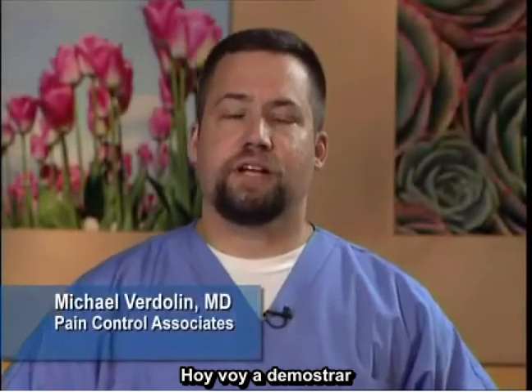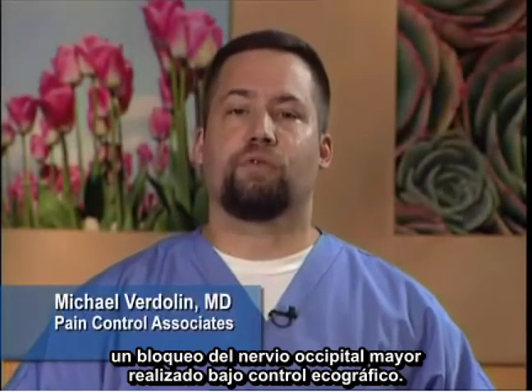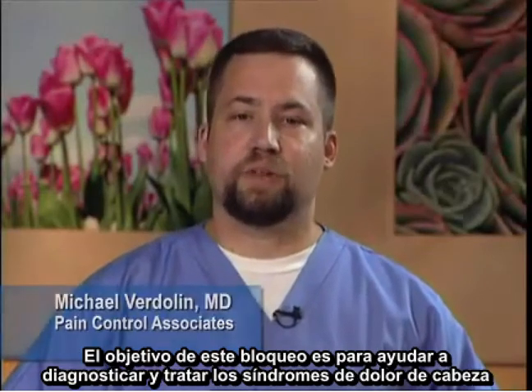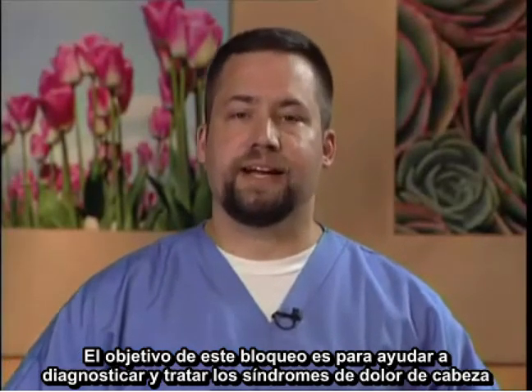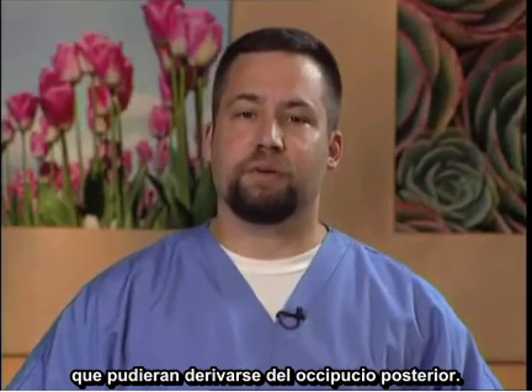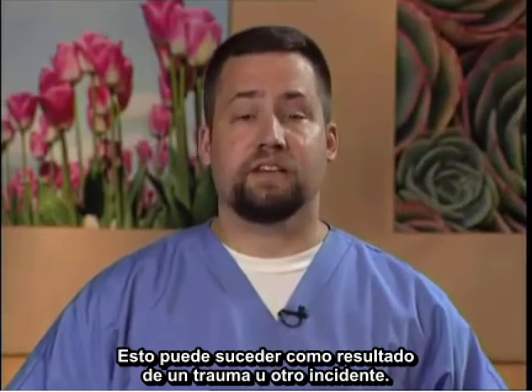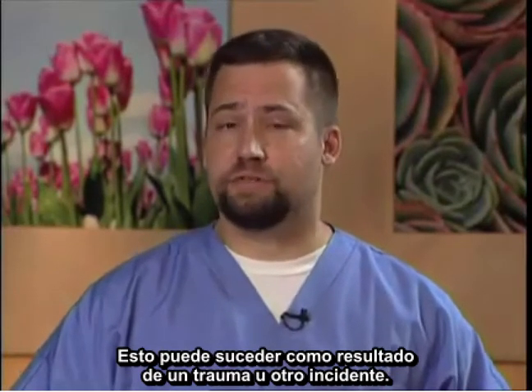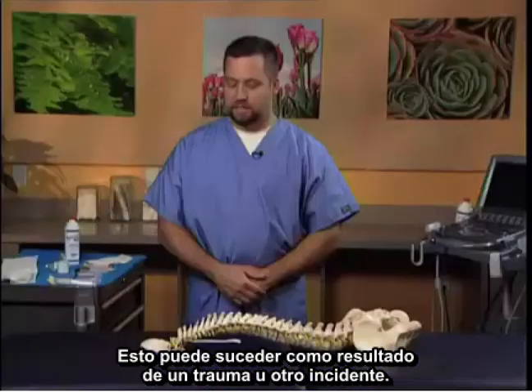Today, I'm going to demonstrate a greater occipital nerve block performed under ultrasound guidance. The purpose of this block is to help diagnose and treat headache syndromes that may be arising from the posterior occiput. This can occur as a result of trauma or other incidents.